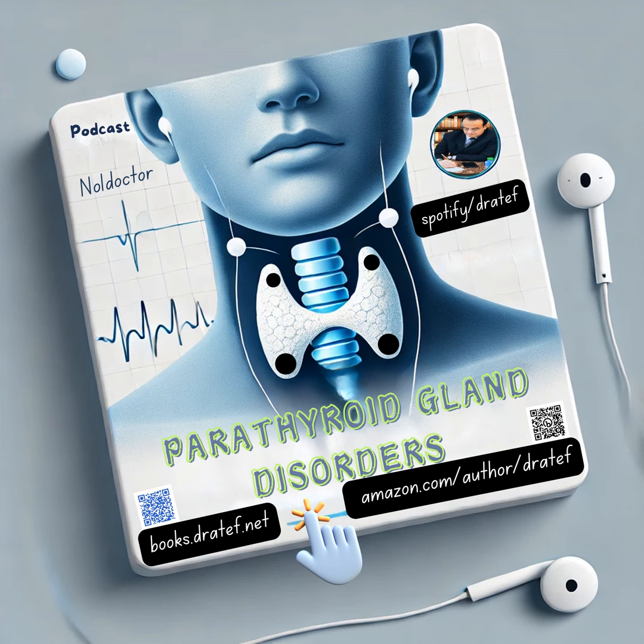Precisely. It provides an extra layer of confirmation that the right gland has been removed and that the remaining parathyroid glands are functioning normally. These protocols sound pretty straightforward, but I have a feeling things aren't always so clear-cut. What happens when those PTH readings aren't so obvious? That's when the real detective work comes in.